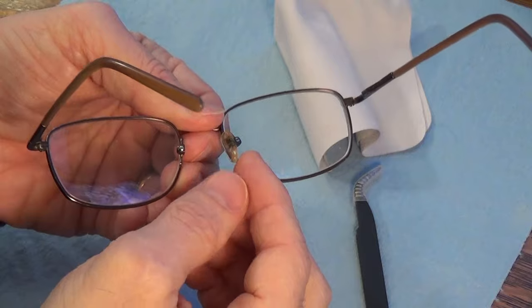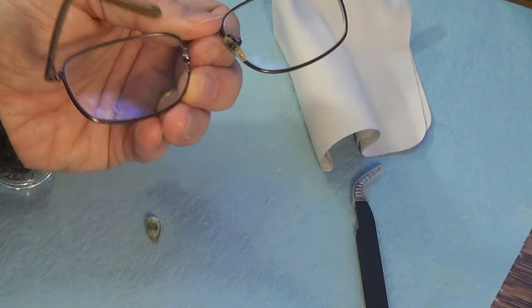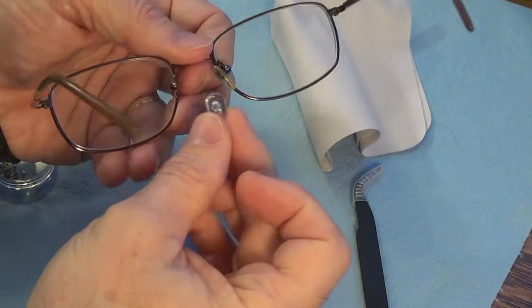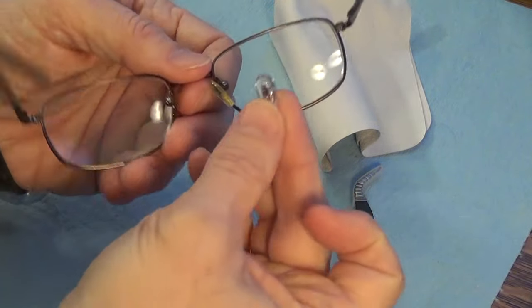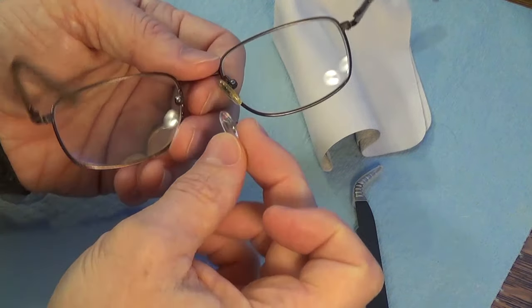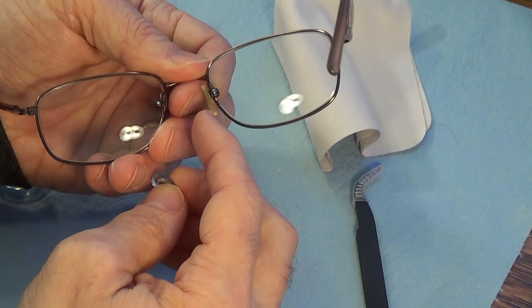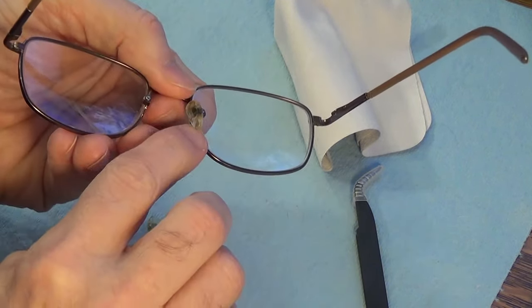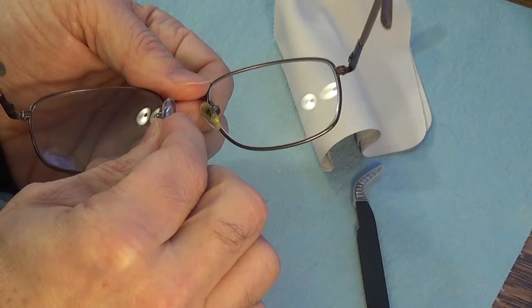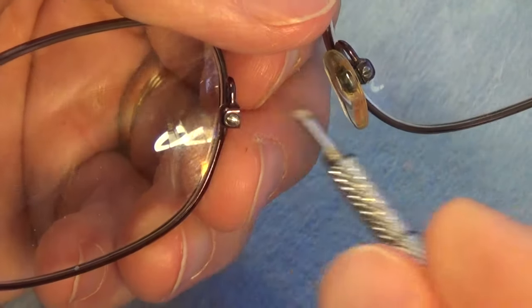Only one nose pad fell off, but I'm going to replace both because the replacement pads are a slightly different shape. The kit came with more than one pad, and the remaining original pad is probably aging and may eventually fall off too. You can also see it's yellowed, so replacing just one with a clear pad would be noticeably mismatched.